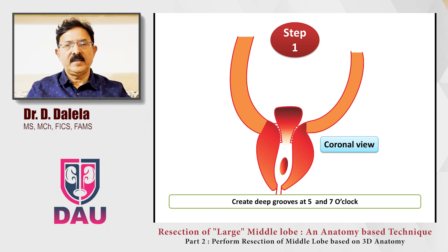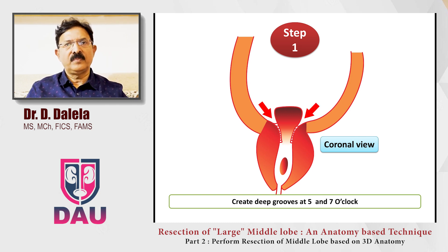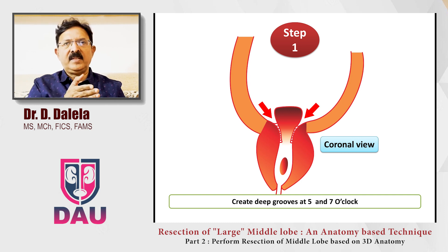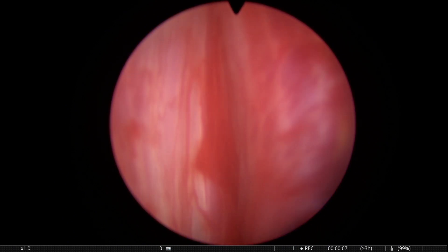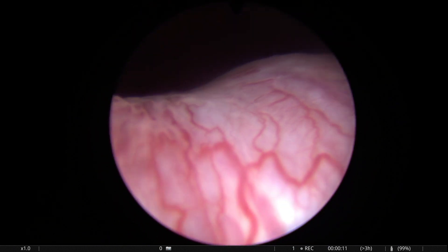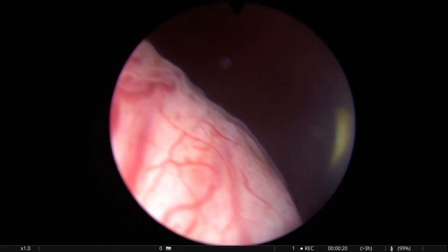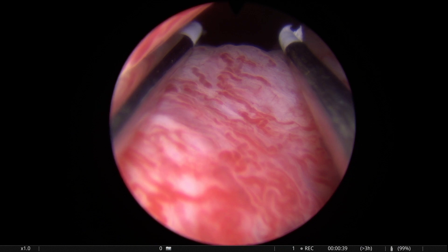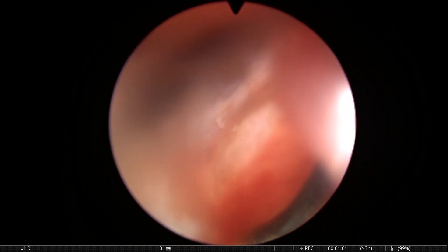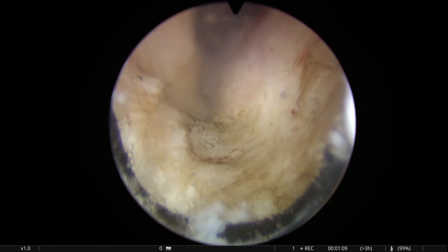The first step is that on both sides of the middle lobe, you dip the groove. In endoscopic view, if you see the verumontanum at the 6 o'clock position, between 4 and 5 o'clock on one side and between 7 and 8 o'clock on the other side, you create two longitudinal furrows. In the video you see here, a groove is being created on my left. The advantage of this groove creation is, number one, the bleeders coming from the lateral side and supplying the middle lobe can be seen and controlled.